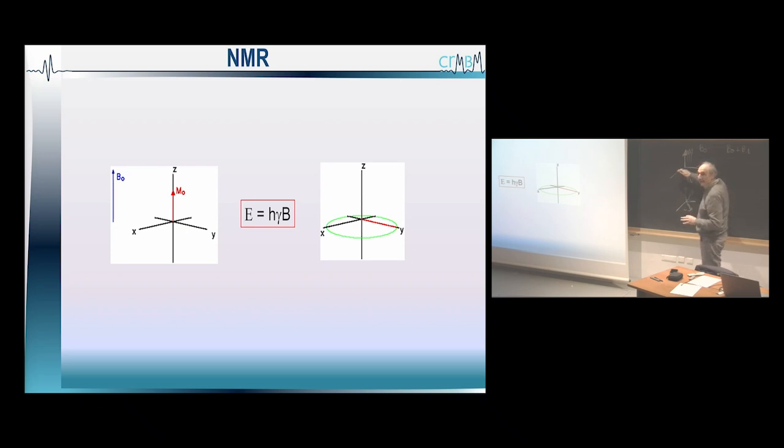In this axial plane, the sum will be 0. If you put B1, you are going to equalize the different levels. So it means that here you will have 2, and here you have 2 as well. And they are still rotating around, like this.